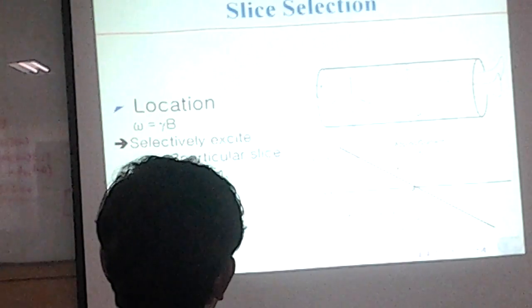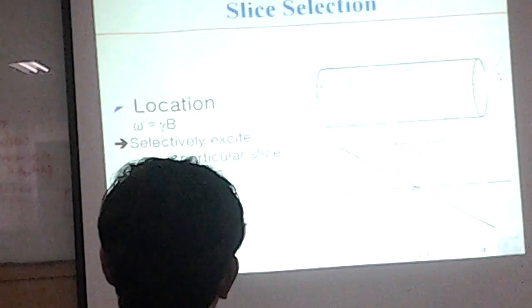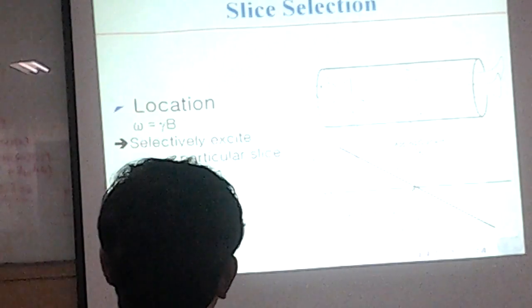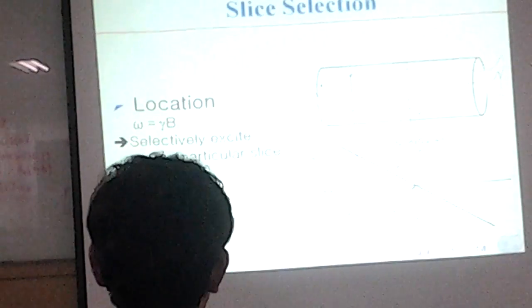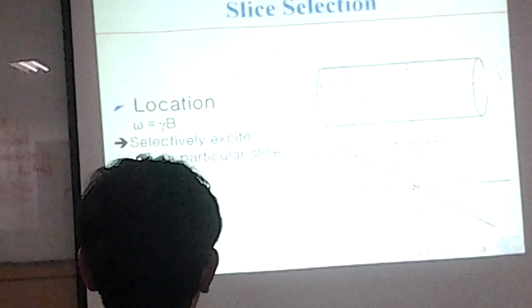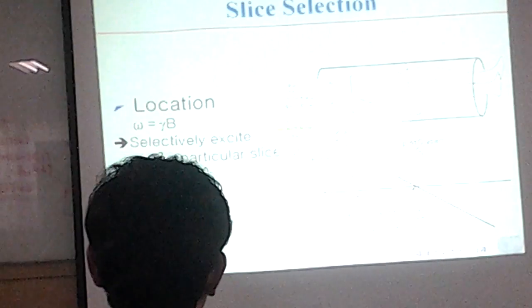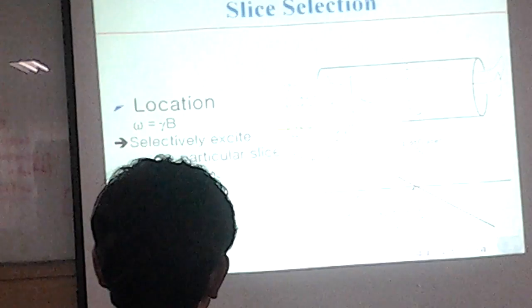According to the resonance phenomenon, spins with frequencies within the range of the RF pulse are excited. Okay, you should understand the resonance phenomenon here. I explained the resonance phenomenon with the bridge photograph, right? Okay.